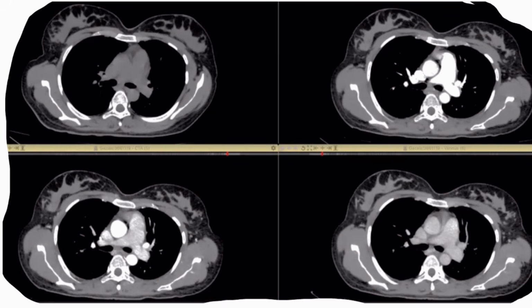By contrast, I mean that the radiologist has injected some iodinated contrast in the body. It is generally around 50 to 150 ml of contrast given for each study based upon the nature of the study. Whenever we are injecting the IV contrast, which is radio opaque, it travels first through the vein into the right side of the heart. Once it enters from the right side, it crosses the atrium, ventricle, then it goes to the pulmonary artery.